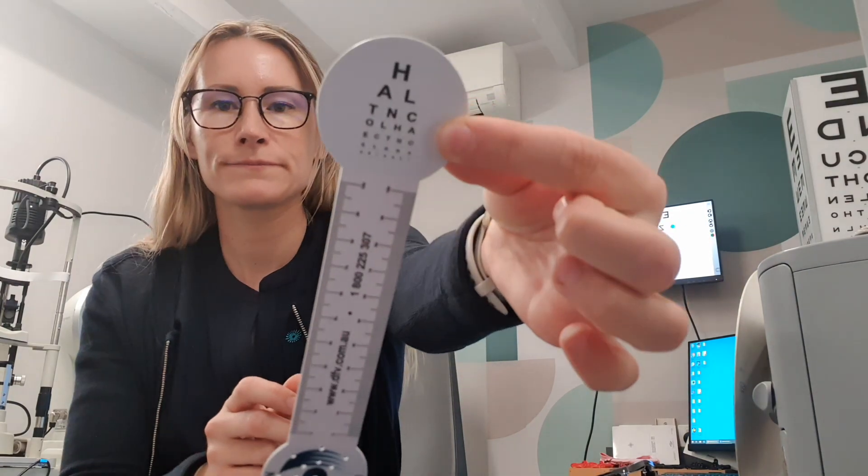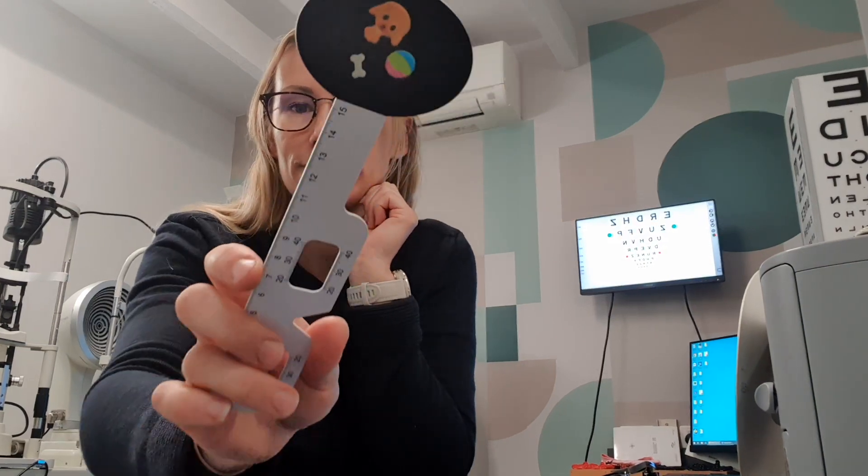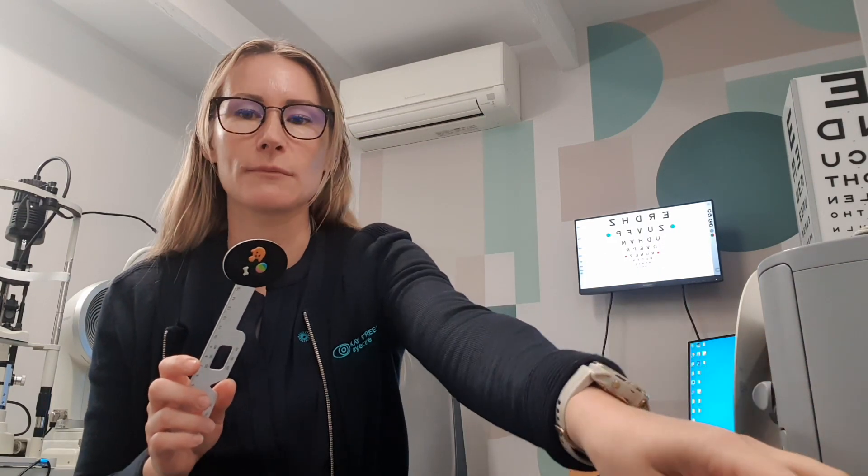We also use these little near-point cards, like the ruler there, or in the case of younger children, little pictures. We use these because a lot of the testing we do is when children are looking up close, and we want to see how their eyes work when focusing on a target up close. We use this to see how they actually focus on the target by bringing it closer and further away. We can also do that with flippers, which can relax the accommodation or cause them to need to focus harder. If they can clear both sides, generally they have good accommodation.